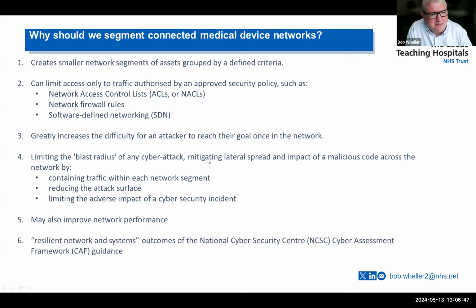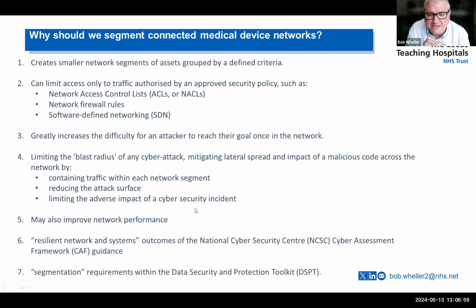Now, as Patrick mentioned, there's the emerging Cyber Assessment Framework, and it's certainly a requirement within that framework, so it will enable compliance with that. And also it is in the DSPT, the Data Security and Protection Toolkit, which is our current submission that we have to do every year. And this year, I don't know if you've seen this year's questions, but they specifically ask about the segmentation of our networks that contain medical devices.